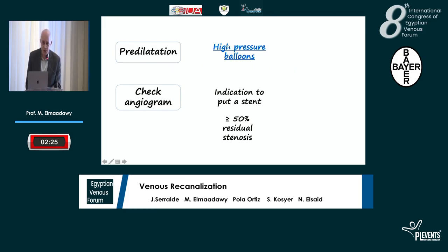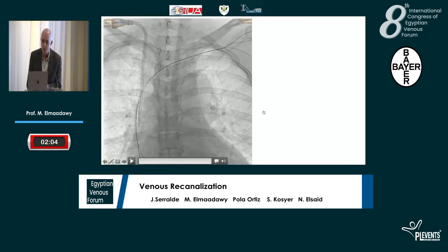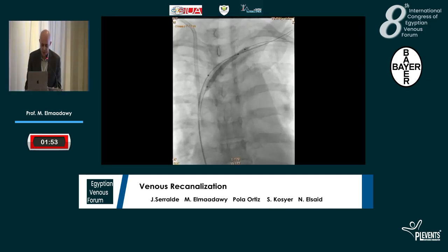As regards balloon dilatation, because of the tightness of the lesion, you need high-pressure balloons to accomplish dilatation, which are not available everywhere. Sometimes you might have to put two balloons alongside over two wires in order to increase the force of each one, to be combined and reach the diameter you desire. Like this case, in which two balloons are placed side by side over two wires and inflated simultaneously to accomplish the goal.